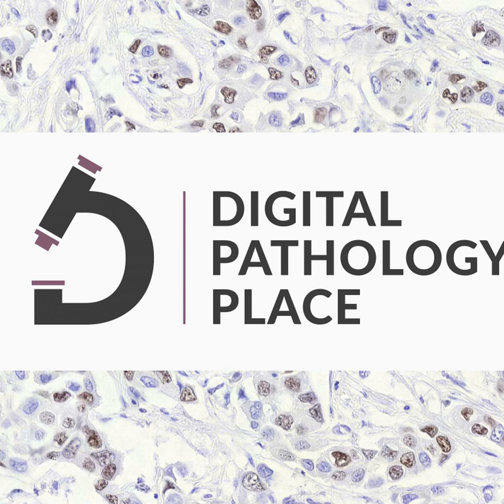And also the discussion is important because then the AI can do the counting of the areas or the cells. It can do the whole slide. Is it 1,151 lymphocytes or positive Ki67 cells? And count the area of the tumors. Then that is how the current system of grading can be converted. So it needs a long discussion.